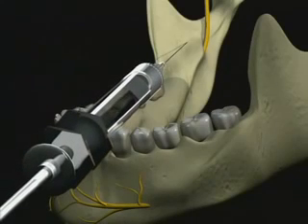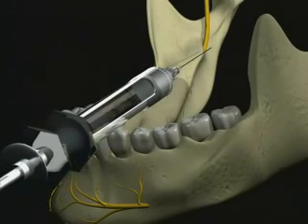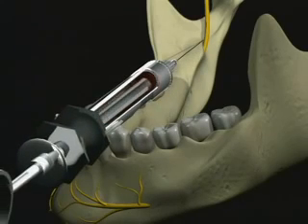If you contact bone too soon, in other words, significantly less than 25 millimeters, you will need to redirect the syringe and carry out the indirect technique. This is accomplished by withdrawing the syringe slightly, moving the barrel more medially over the contralateral canine or incisors, and advancing again until bone is contacted.